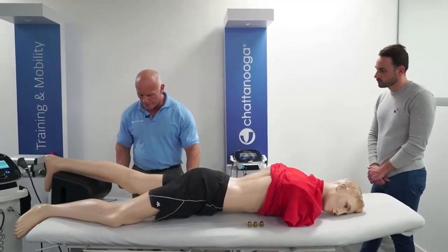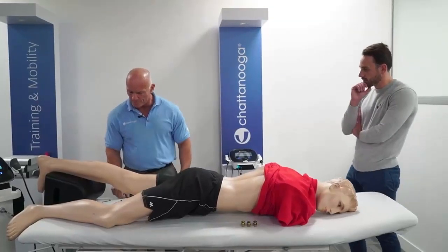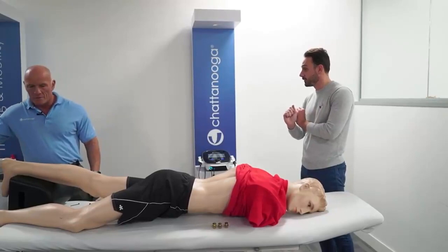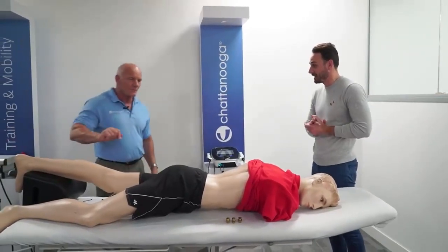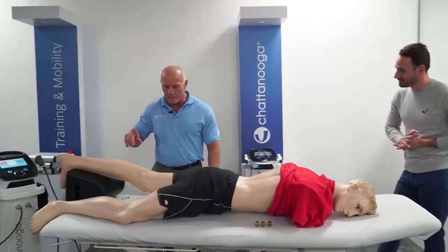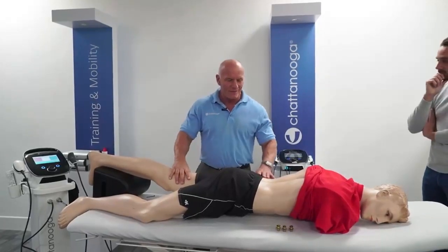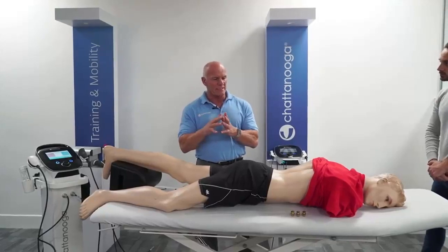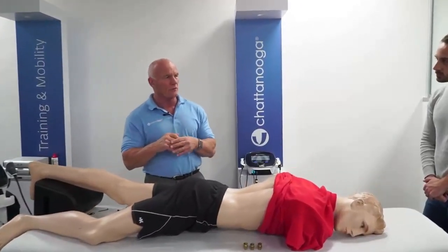And then the final question: I've heard that it's supposed to be quite uncomfortable. What can you do to make it more comfortable for your patients? And what is that white thing over there that you're pointing at? Okay, so on this point of discomfort, this is a big misnomer, and I'm glad we've got the opportunity of addressing it today.